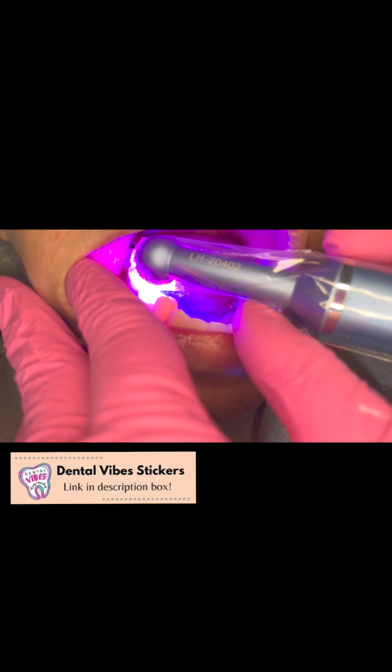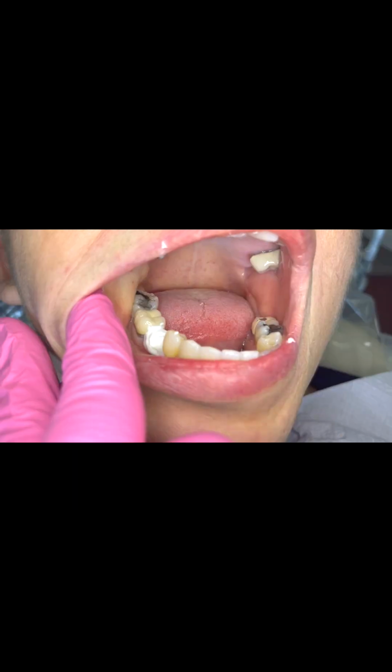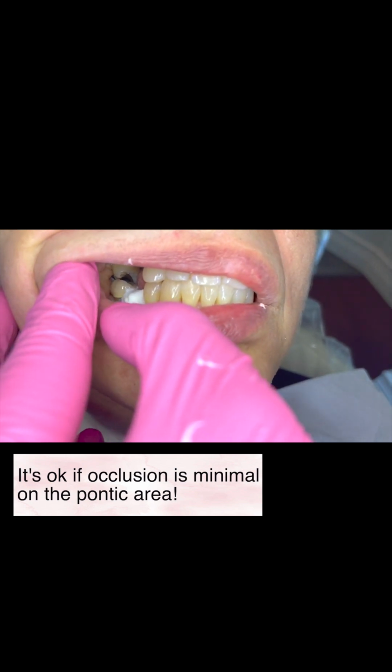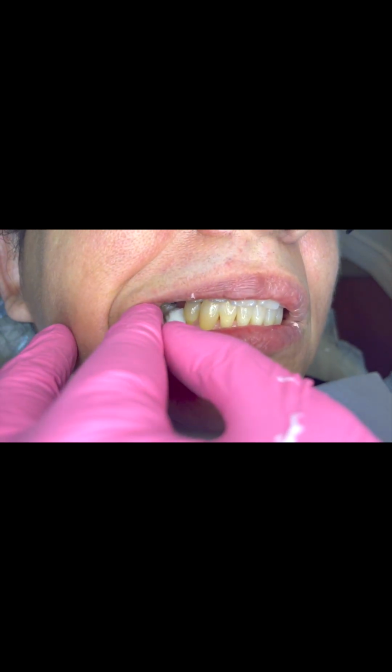And then one thing you want to double check is the patient's bite. So you don't want to overbuild that bite. In this case, I got kind of lucky because there isn't an opposing tooth, although the patient does wear a partial. So I do gotta be mindful. I don't want to be adjusting the bite forever after I make that temporary bridge. So I leave that space a little bit open and take my impression.